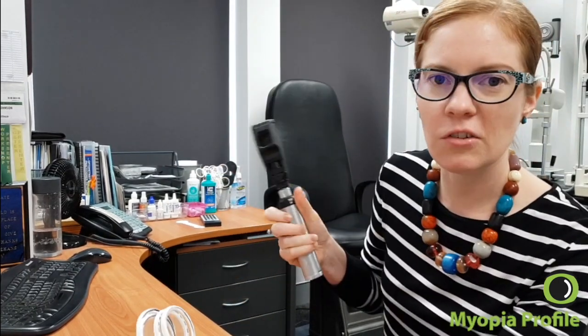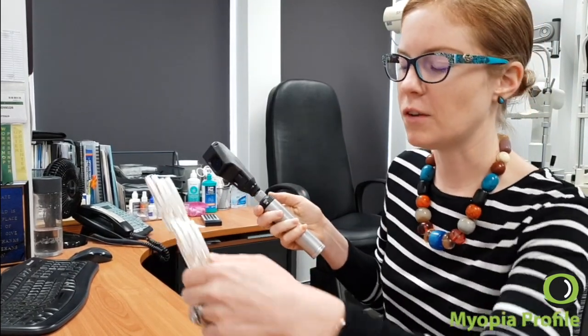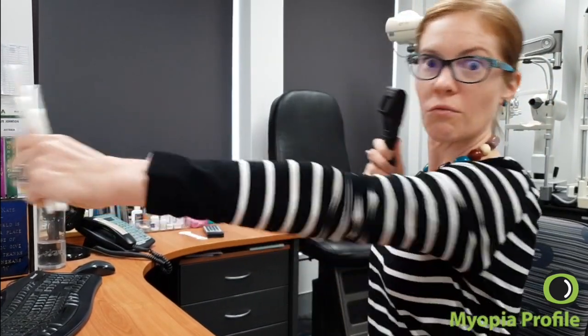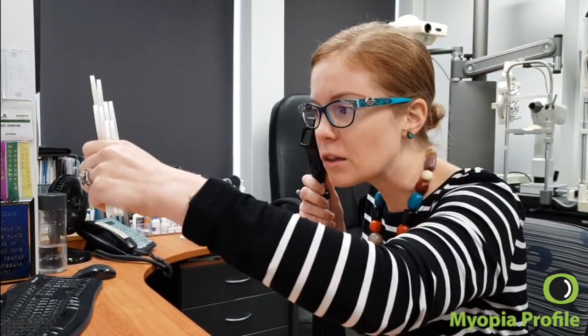The easy thing about accommodative lag measurement is that when you do retinoscopy, whatever result you get is the near RET result — you don't have to do any working distance correction. It is important, though, that you don't RET at your normal distance, because we don't read at that distance. We read at a close distance, so we need to make sure we're at an appropriate distance of 33 to 40 centimeters to take these measurements.